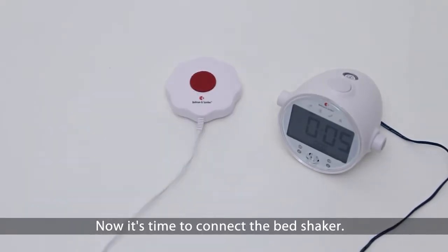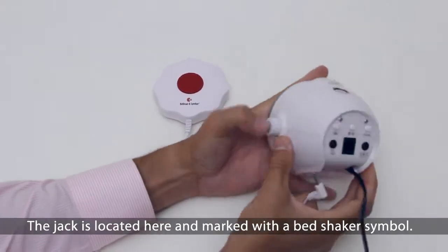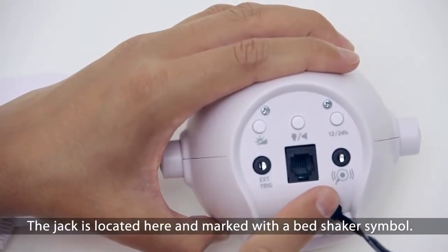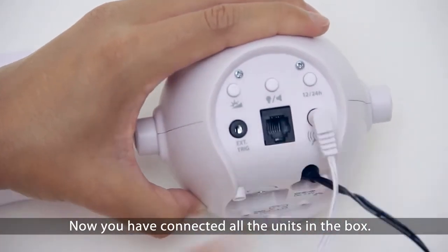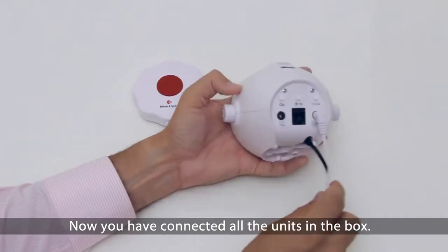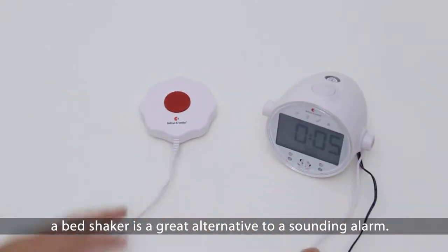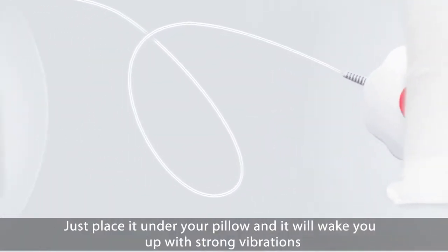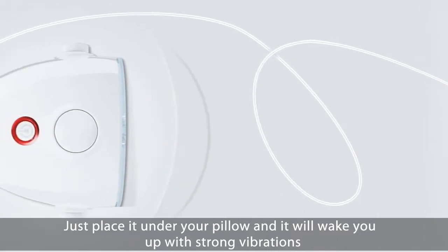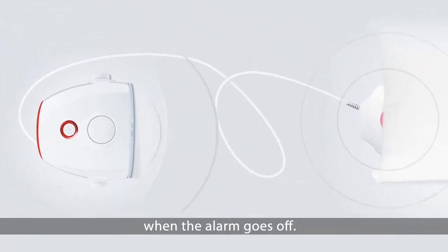Now it's time to connect the bed shaker. The jack is located here and marked with a bed shaker symbol. Now you have connected all units in the box. When you want to get up in the morning, a bed shaker is a great alternative to a sounding alarm. Just place it under your pillow and it will wake you up with a strong vibration when the alarm goes off.